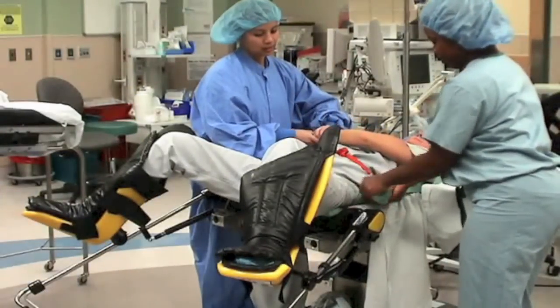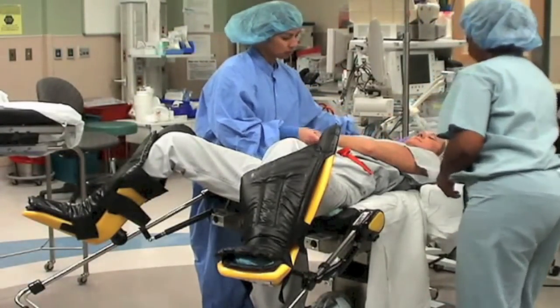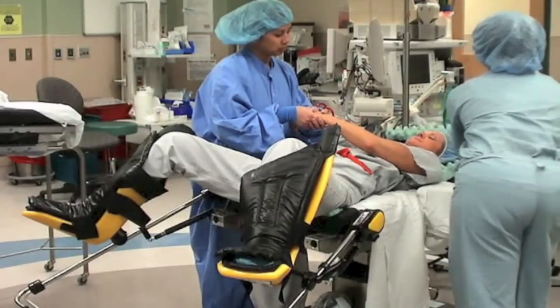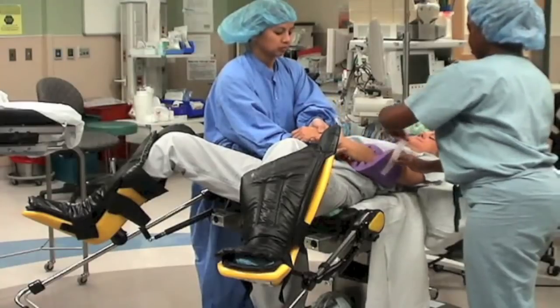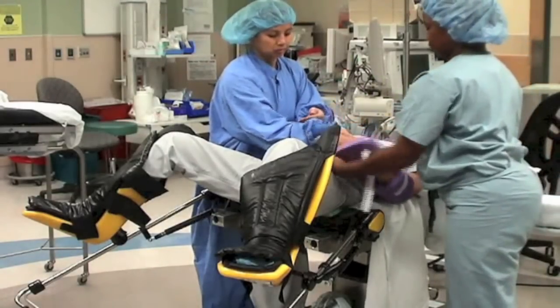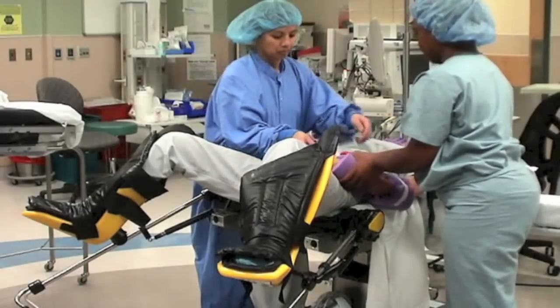The arms are carefully tucked at the sides. The excess egg crate foam is removed from the patient's side and cushioning is placed around the patient's elbow and wrist. The bedsheet is lifted over the patient's arm and the sheet is tucked beneath the OR bed mattress. The excess egg crate foam is placed beneath the patient's fingers.